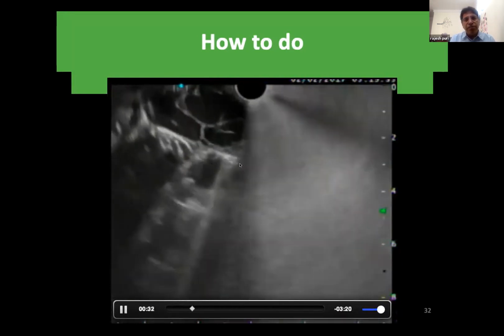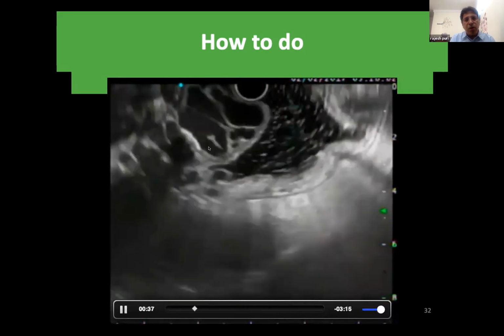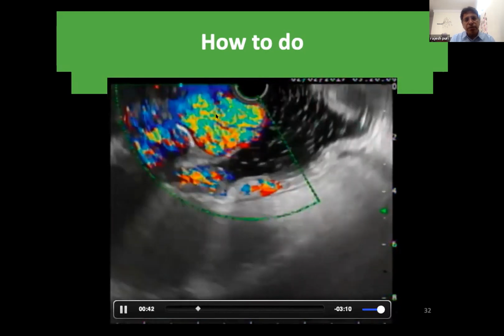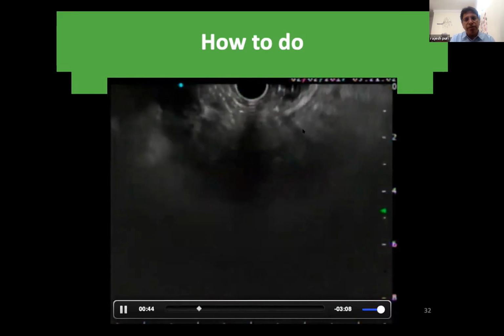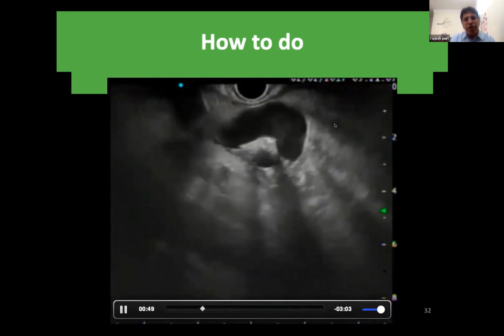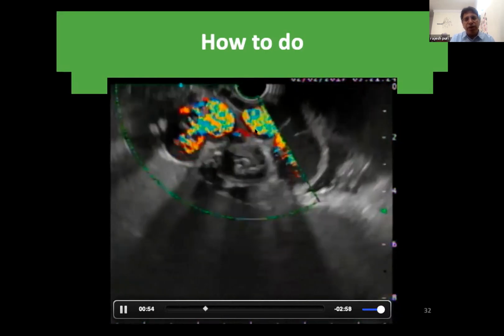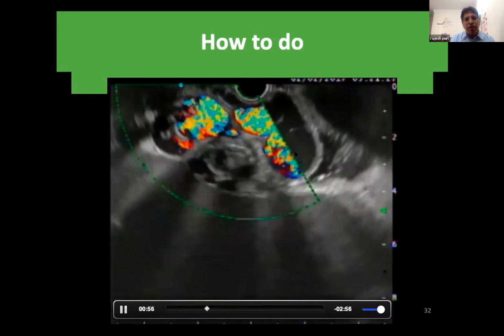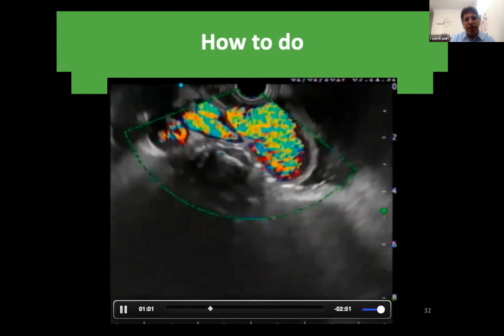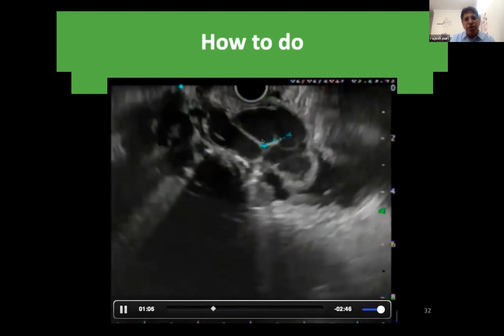So you see here, this is the gastric lumen. This is the wall of the fundal varix. This is the fundal varices. This is the gastric lumen here. Now, these are the collaterals, large collaterals. Avoid puncturing these collaterals. No point in injecting the coil and glue in these collaterals. You always inject the intramucosal aspect of the varices. So these are the varices which need to be targeted. These are outside the gut lumen. These are the perforators. So your intention is to inject this.